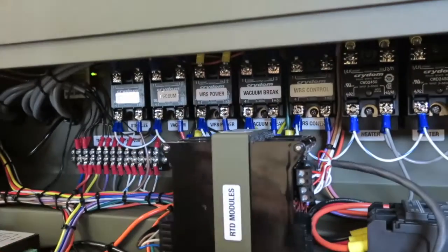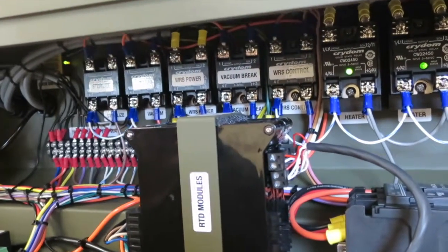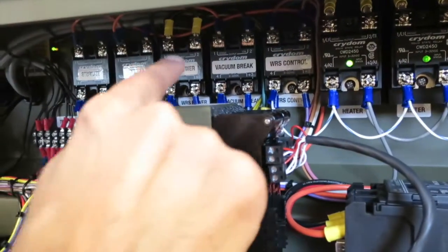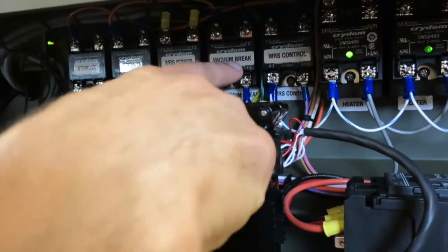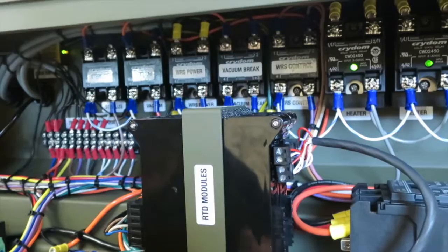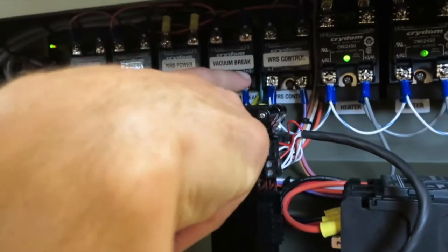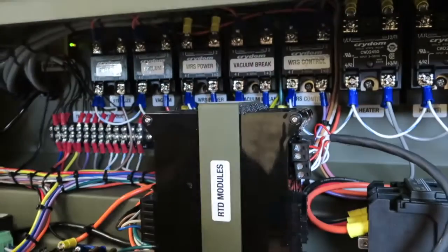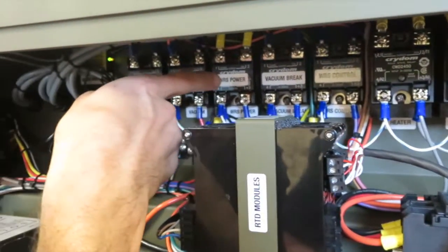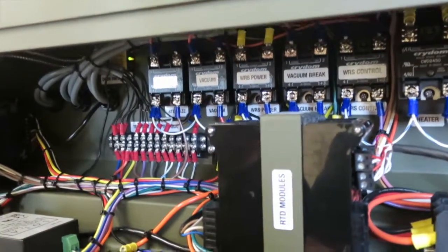The vacuum brake valve, again, is on the other side that we already talked about. So whenever the cycle dictates to open that valve, the PLC will send 24 volts to that solid state relay. Finally, the water recovery system control. This is for during a cycle when the sterilizer needs to turn the water recovery system on. It will send power to this relay, which will turn the water recovery system on during a cycle. So again, this one is always on for the toggle switch, and that one is on for during a cycle.